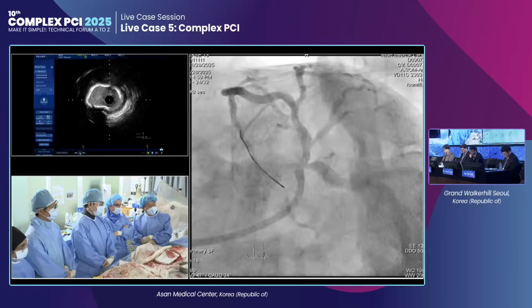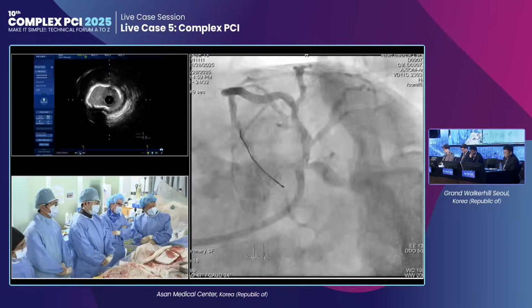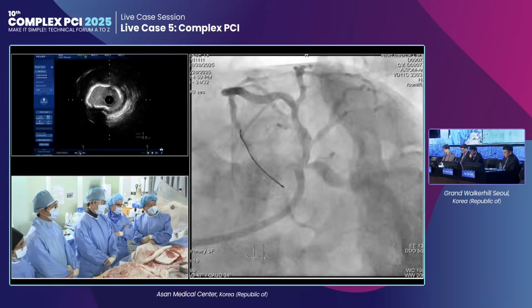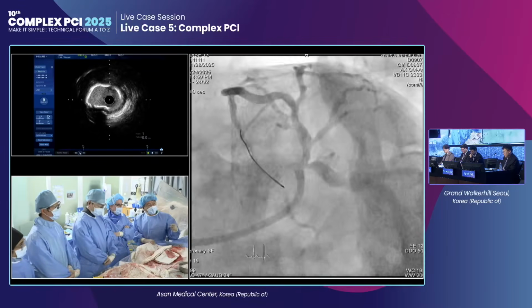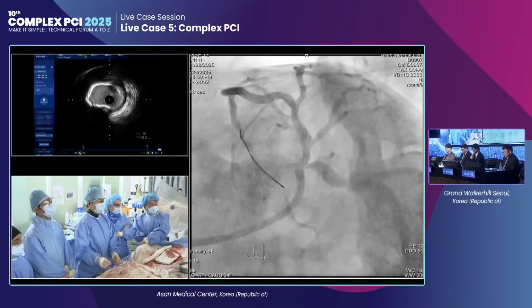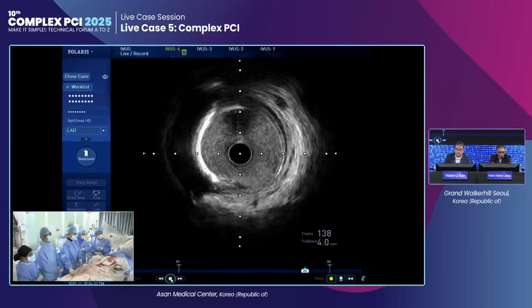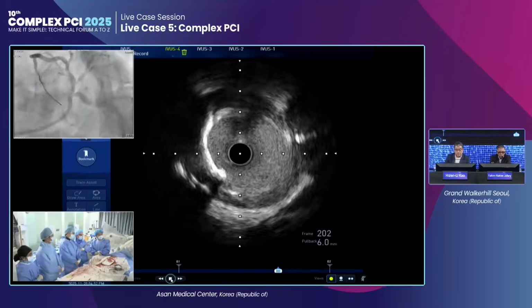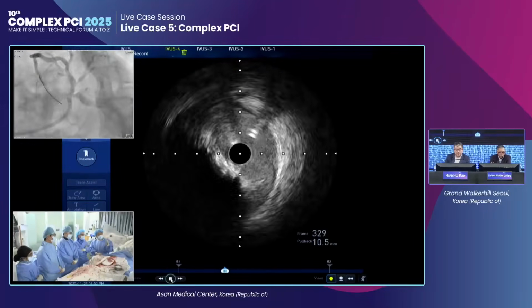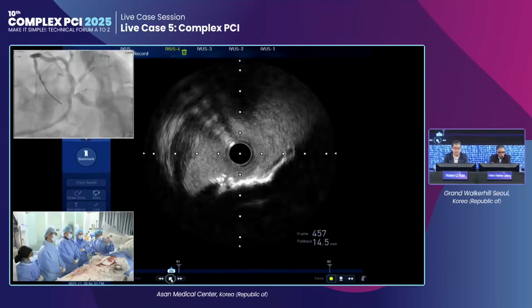All right, then, what do you think? Angiographically it looks better. It's very difficult to get a good angiographic result with this eccentric calcium. So, IVUS again. Is there a bit of carina shift in the circumflex? Yes, exactly. And after stenting, unfortunately, this carina shift will get more pronounced, worse. After the cutting, it's getting a little bit better.